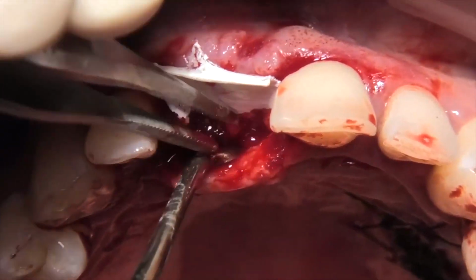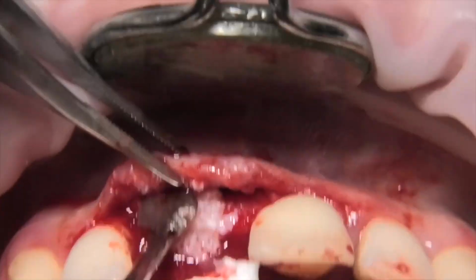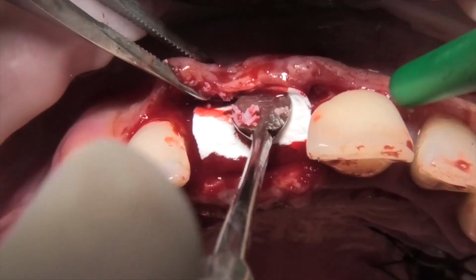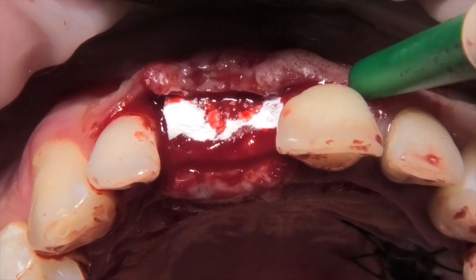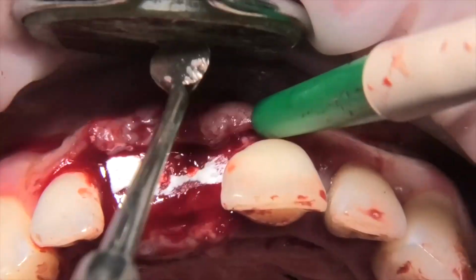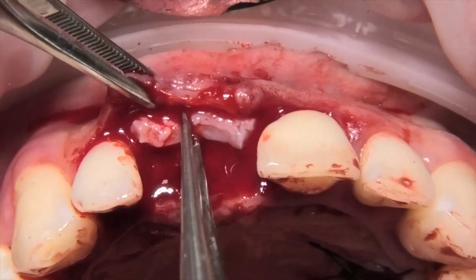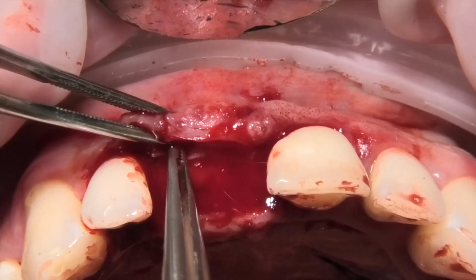And now, a porcine collagen membrane, appropriately shaped outside the mouth in a sterile environment, is inserted and blocked under the palatal flap, above the bone crest. An autologous bone graft taken from the drills during the implant preparation is mixed with deproteinized bovine bone and positioned vestibularly to the head of the implant to perform a horizontal GBR, which will allow me to have a vestibular bone thickness for my implant of at least 2 mm, as described in the literature.